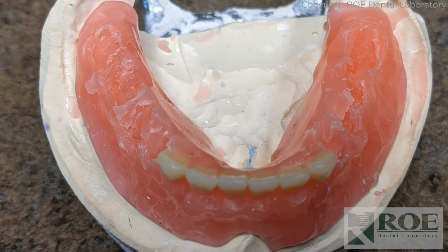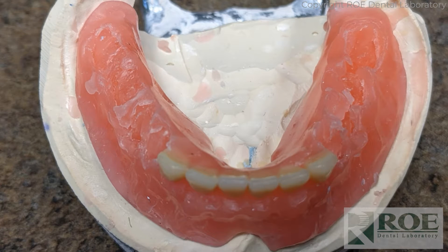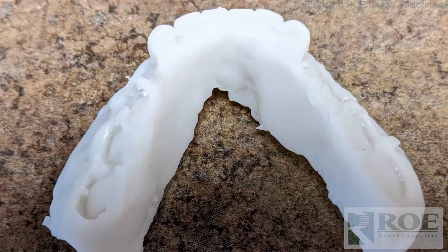The bite was off, so the doctor took the teeth off and scanned the denture. He's pretty digitally savvy, so he created essentially a custom tray of the wax up. The teeth came off, he scanned it, gave some density to it, and printed it like a custom tray. With that custom tray, we went to surgery.